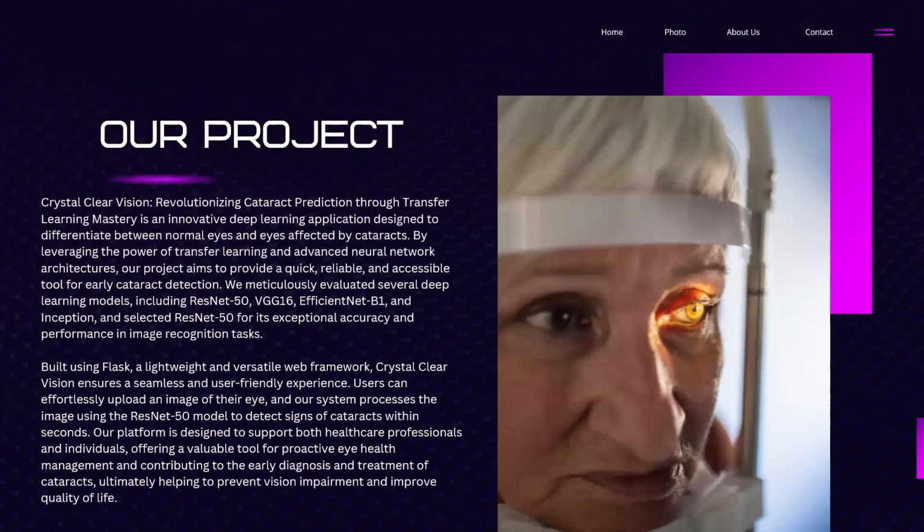In Project CrystalClear, we have used four model architectures, namely ResNet50, VGG16, EfficientNet B1, and Inception. Over all these models, the accuracy of ResNet50 was the highest, which is 90%. So we proceeded with further tasks using ResNet50. And we have built the web app using Flask and basic static HTML and CSS.